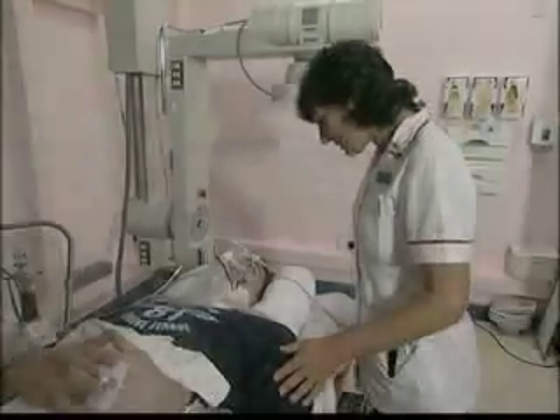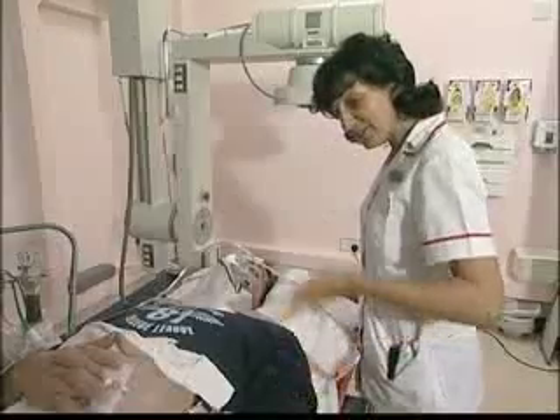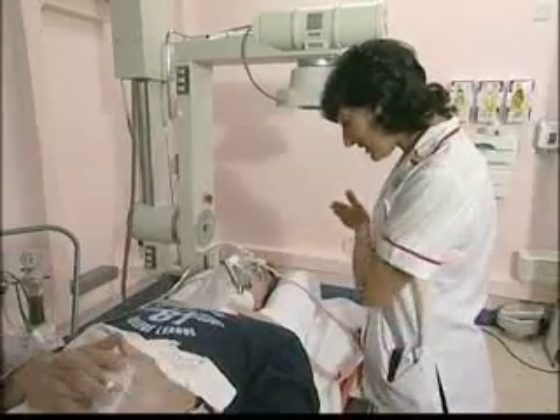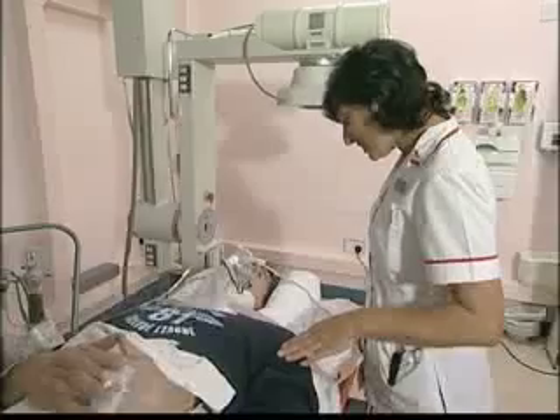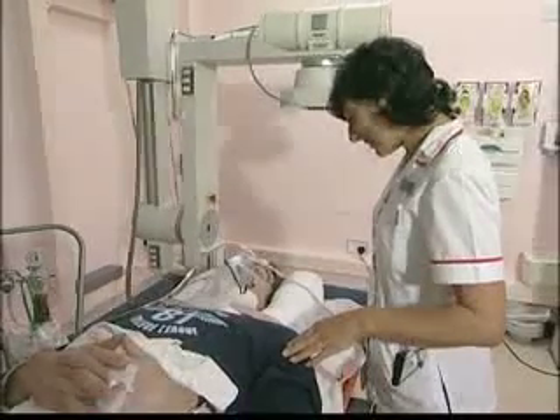OK Alan, what we're going to do now is take some X-ray pictures of your head and neck. To do this we have to move the table upwards and then move the table into the skull unit. Nothing's going to hurt or touch you and all you have to do is keep still for me. Is that alright?